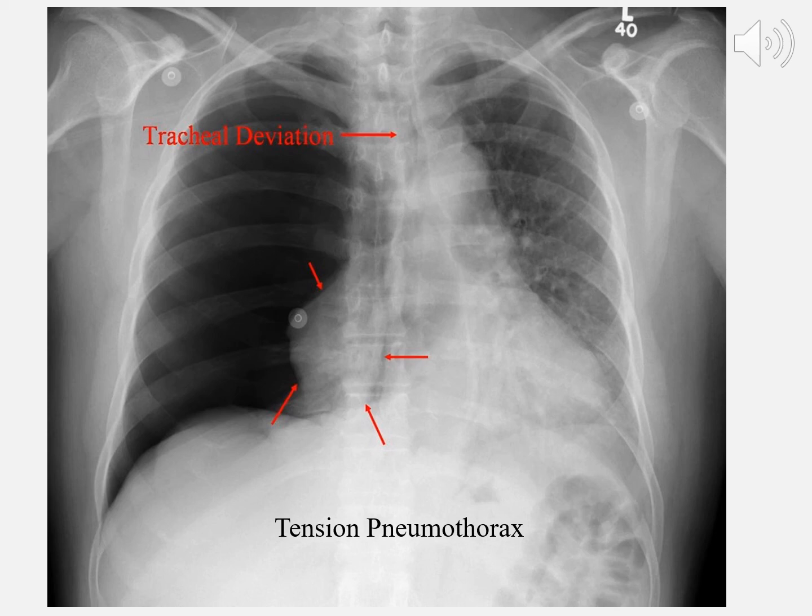So I'll tell you, this is the first x-ray I ever missed as a nurse practitioner. Not a tension pneumo, but I had a probably 17 or 18-year-old kid, a young adult, come in when I was working the ER. I don't know, 6'3", thin guy, no fever, sat 96, saying he had a cough, and every once in a while when he breathes, he felt like he could hear a gurgling sound. It was a little bit of a red flag, but I listened. I really thought I heard good breath sounds. I did an x-ray. I didn't see anything.